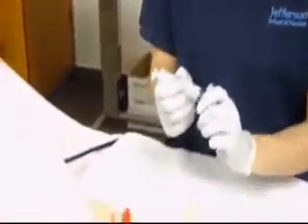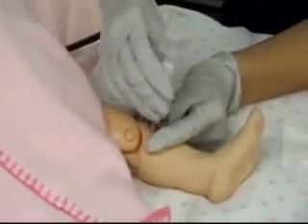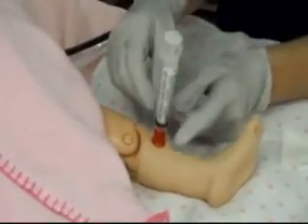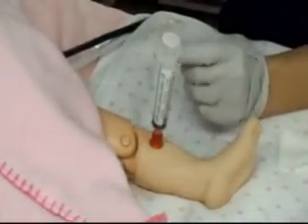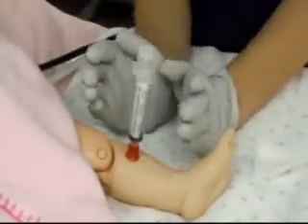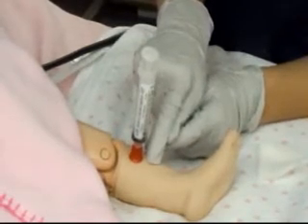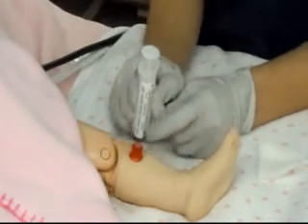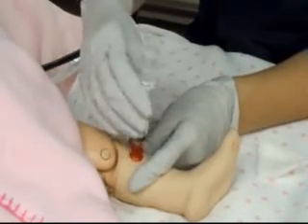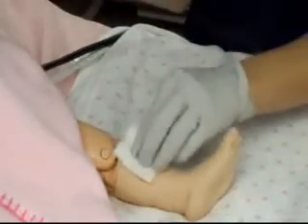All you do is you take the Luer-lock tip and you're going to hook it into the hub of the catheter. And while you take it out, you're going to pull straight back and turn it clockwise. You don't want to wobble it from side to side because that could potentially disconnect the hub from the catheter that is in the patient's leg, or it could also break the needle that is in the bone. So just pull straight back and clockwise and then apply pressure.